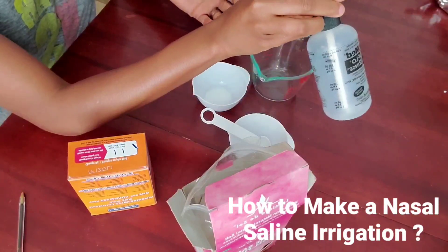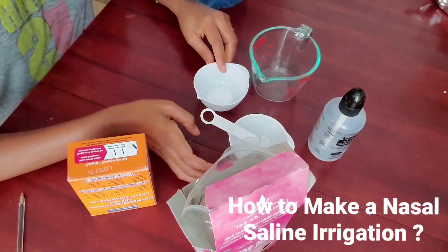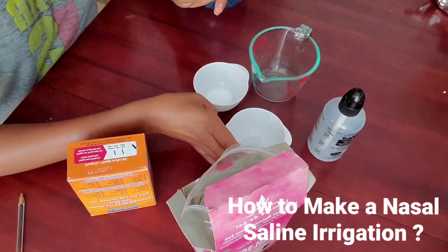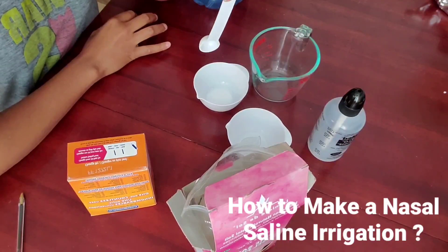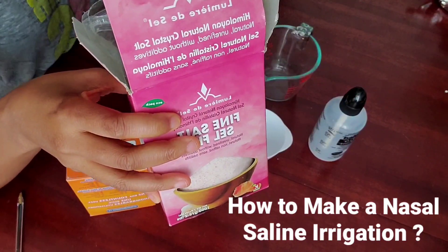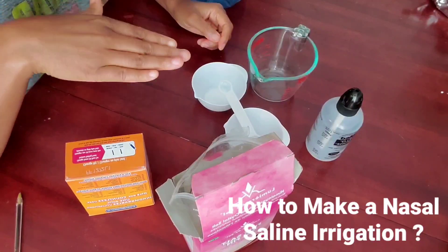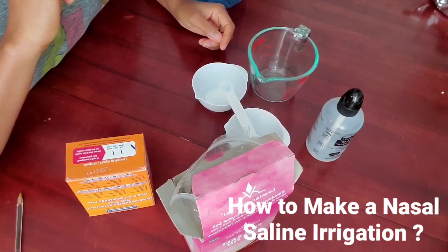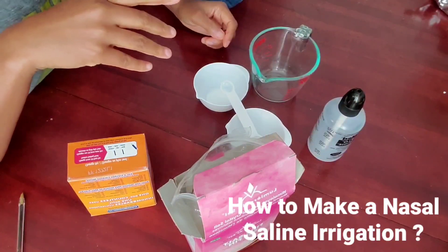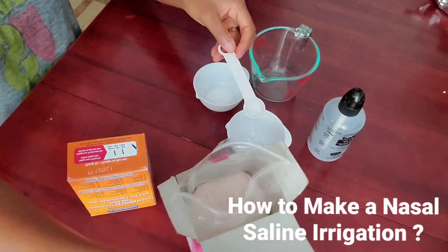What you're going to need is a nasal rinse bottle, a measuring cup — two cups or even one cup is enough — a teaspoon measurement, and salt. I prefer using Himalayan salt. Remember, when you're buying salt, make sure you buy non-iodized salt with no preservatives. And you're going to need distilled water or boiled water — more specifically, eight ounces.